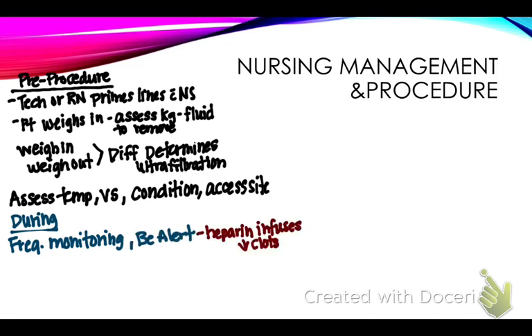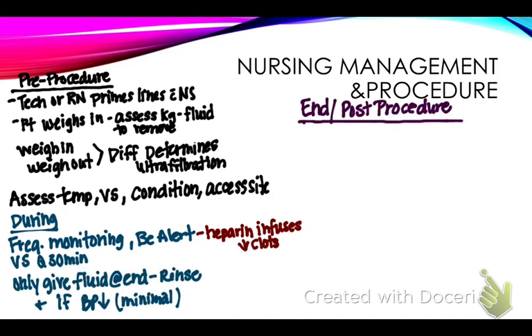You have to be alert because heparin's infusing. Sometimes too much fluid's pulled off and they can bottom out their blood pressure. So there's different things that can happen. But we're doing vital signs frequently. And we sometimes only give fluid if they have a blood pressure that bottoms out.